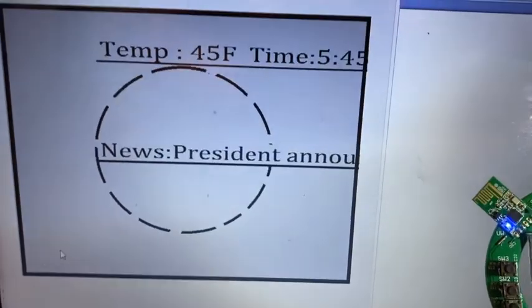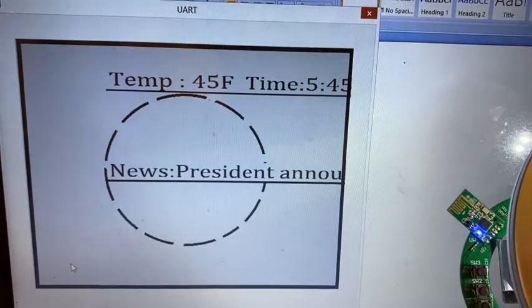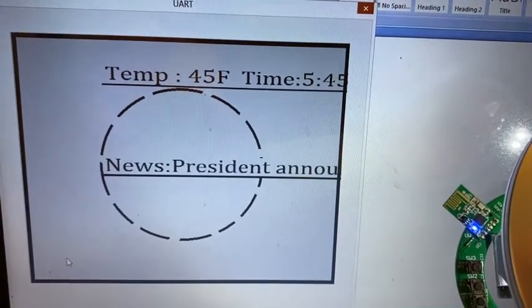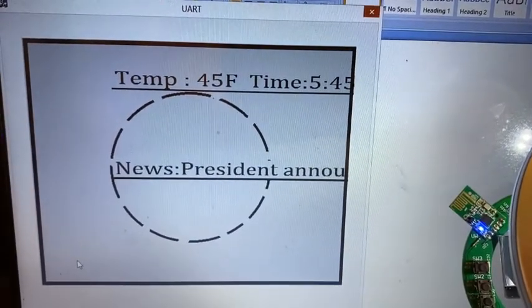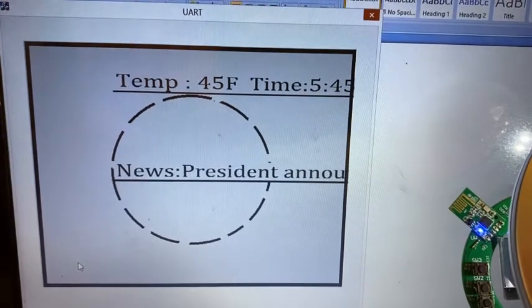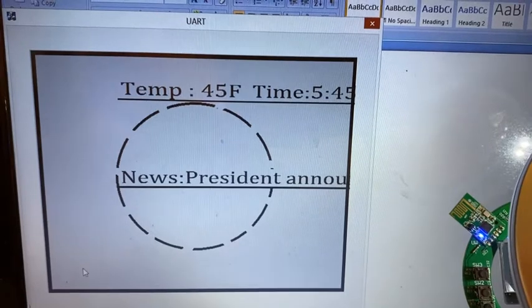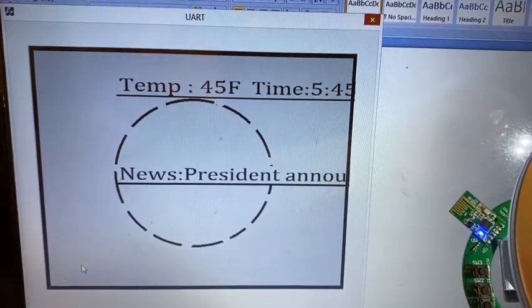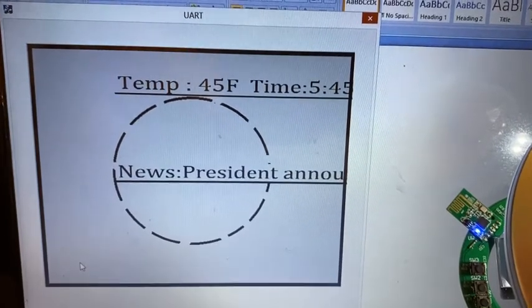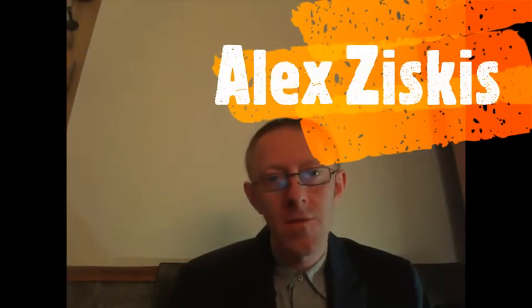Now we'd like to build on this technique, which is a patent pending technique, and we want to demonstrate to you the system of control, which is very revolutionary and enables us to basically control everything that happens in our computer, assuming the interaction with the computer is through the contact lens. The entire control is rendered through the use of the eye. Now, we'll describe the system of control.